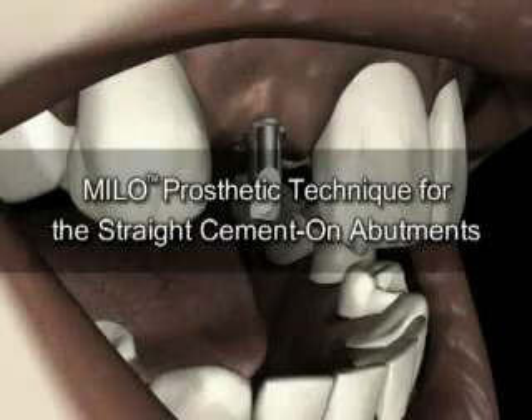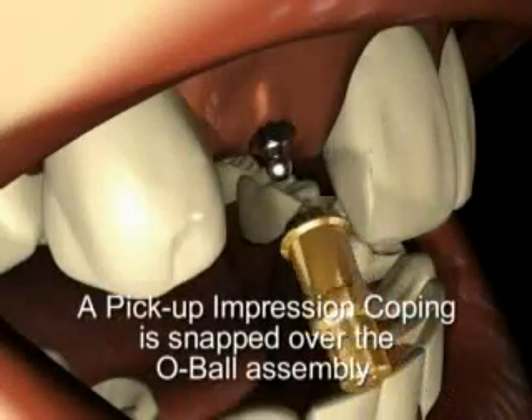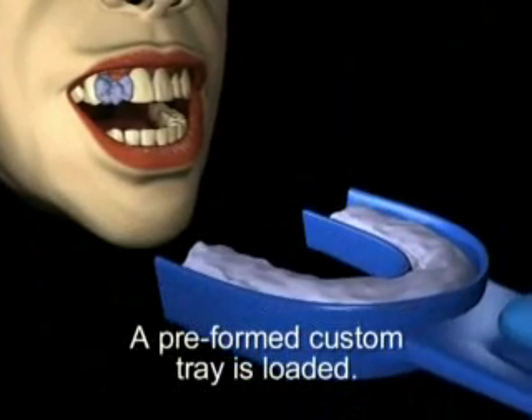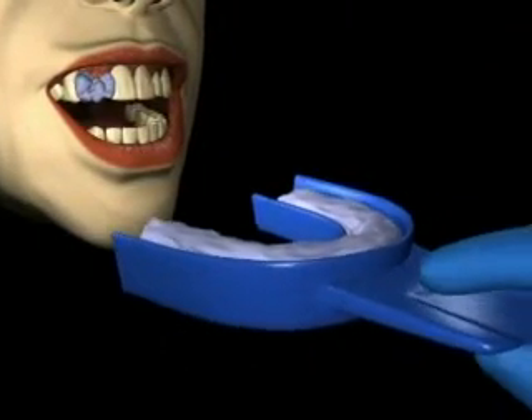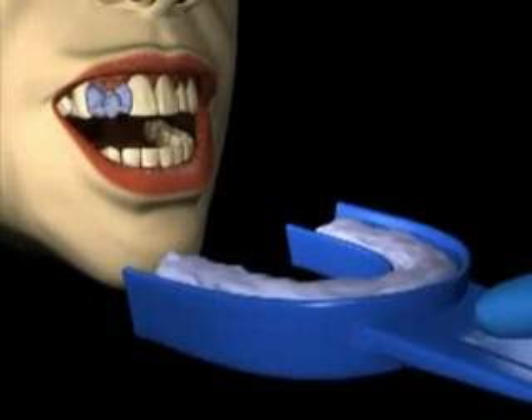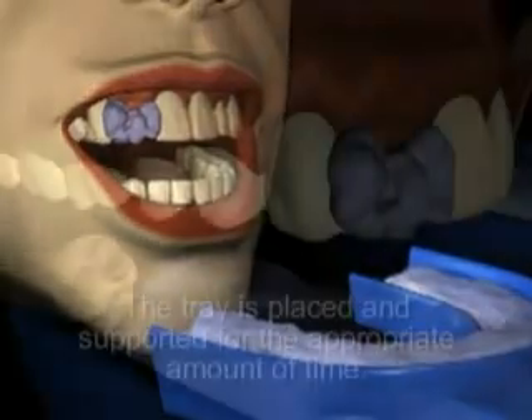Once placement of the implant has been accomplished, the prosthetic component of choice is ready for use. In this instance, the final restoration will be made using the Milo straight cementable abutment. A Milo pickup impression coping is snapped over the o-ball implant assembly. A preformed custom tray is loaded while syringe material is expressed over the pickup coping and adjacent teeth.